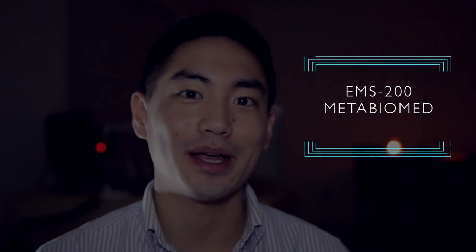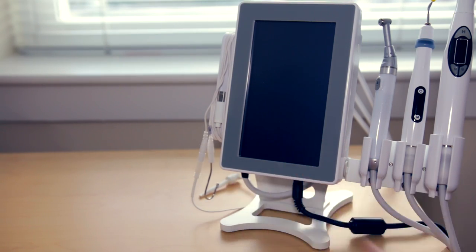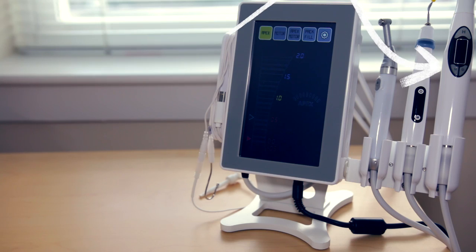Hello everyone. Today I want to demonstrate how I typically complete a root canal from start to finish using the EMS 200 by Metabiomed. I really like this equipment — it's all-in-one, so it includes the apex locator, the motor, the heat source, along with the obturation devices. It's only made possible to do this in my apartment because of its portability and ease of use.